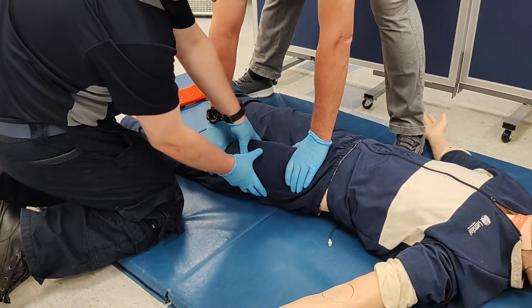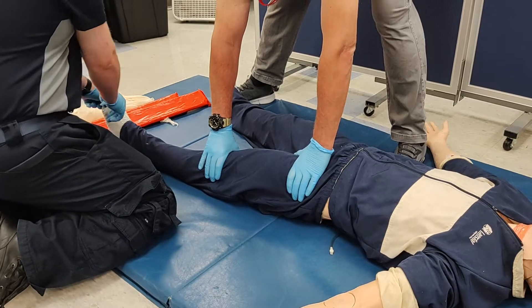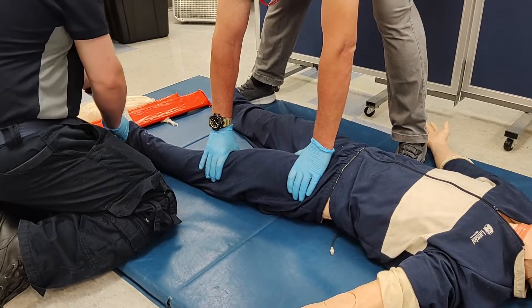We'll expose the injury, investigating to see if we have any open fractures, moving all the way down to the foot and checking distal PMS.